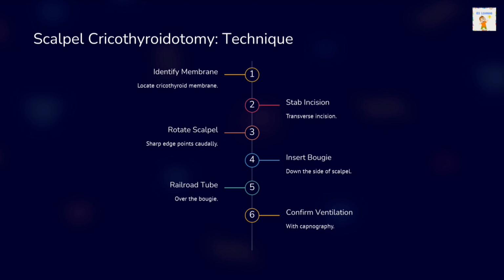You realize we are entering here at the level of the cricothyroid membrane. So it is below the thyroid cartilage but above the cricoid. Our tube will still pass, as it is above the level of the tracheostomy that we do. And the tube will not pass through the larynx, because the larynx is located at around the level of the mid-thyroid cartilage. Here we are going below the thyroid cartilage.